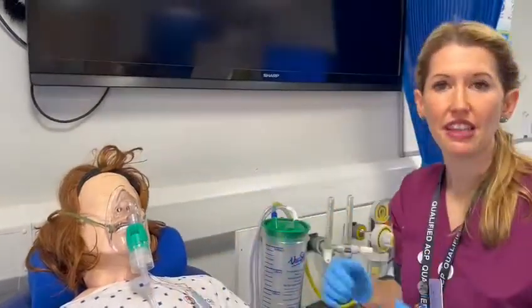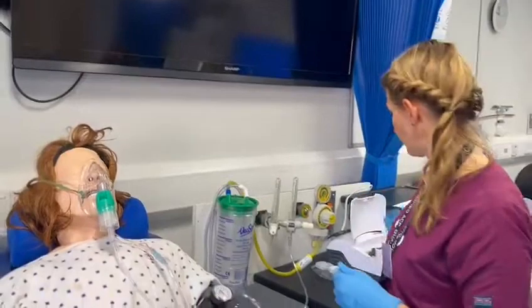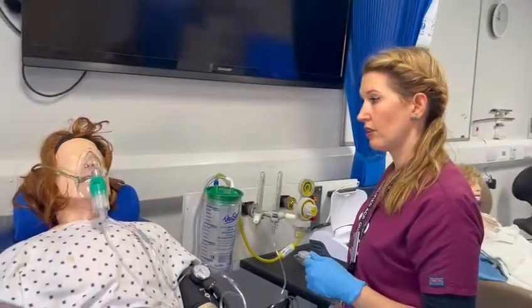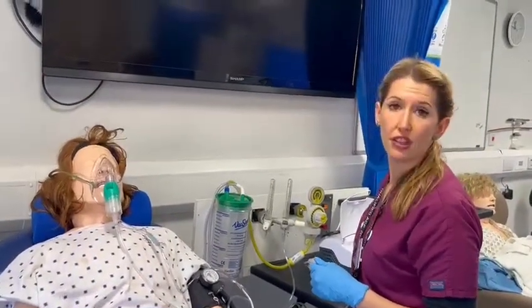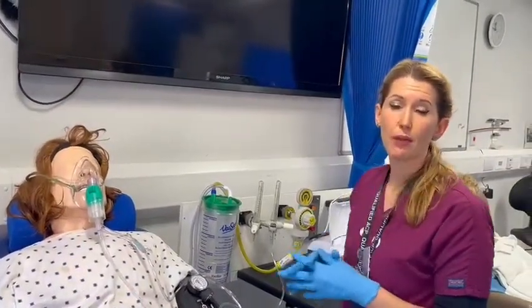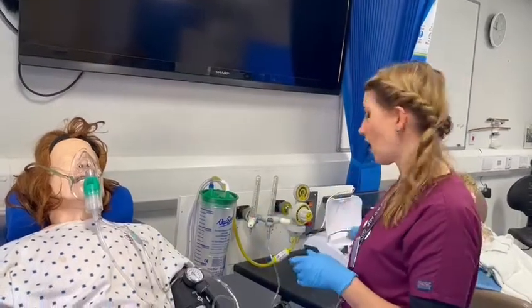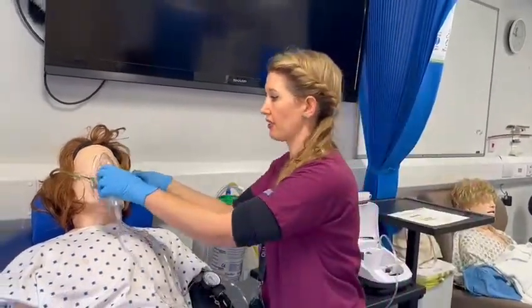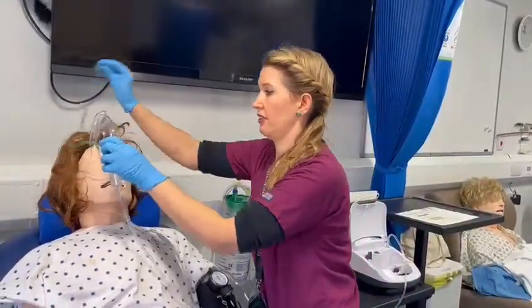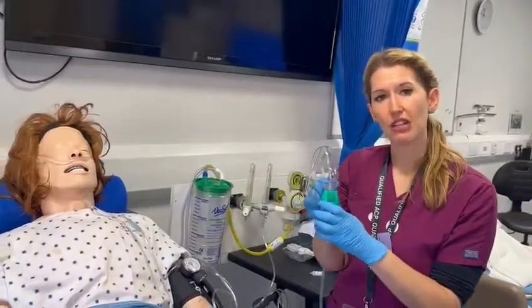It will mist up against their face. Once the nebuliser is finished, you can turn it off and remove the mask. Make sure you clean the chamber at least once a day.